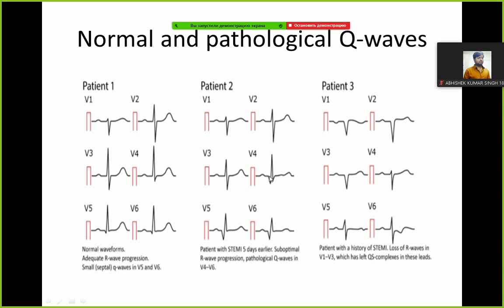Its duration is more than 0.03 seconds and its depth is more than 25% of the R wave. In this case, Q wave reflects necrosis of cardiomyocytes.